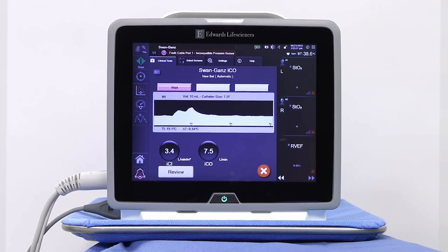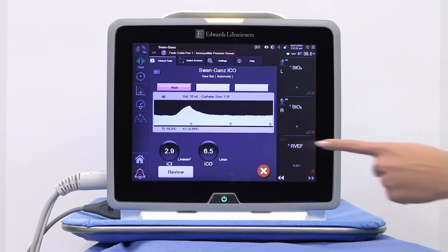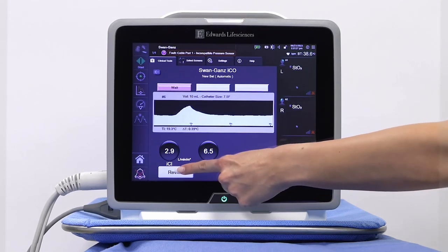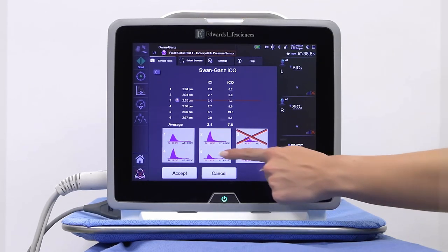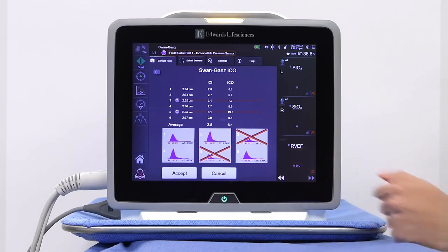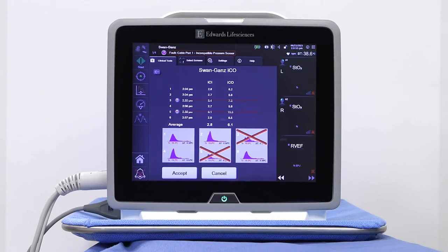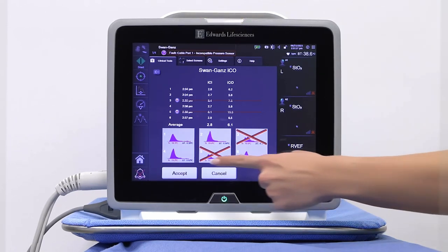After the desired number of bolus injections have been performed, review the set of washout curves by touching the Review button. Remove any reading from the final calculation by touching it on the review screen. A red X will appear over the reading and it will not be considered in the final calculation. Touch Accept to compute the average ICO value.